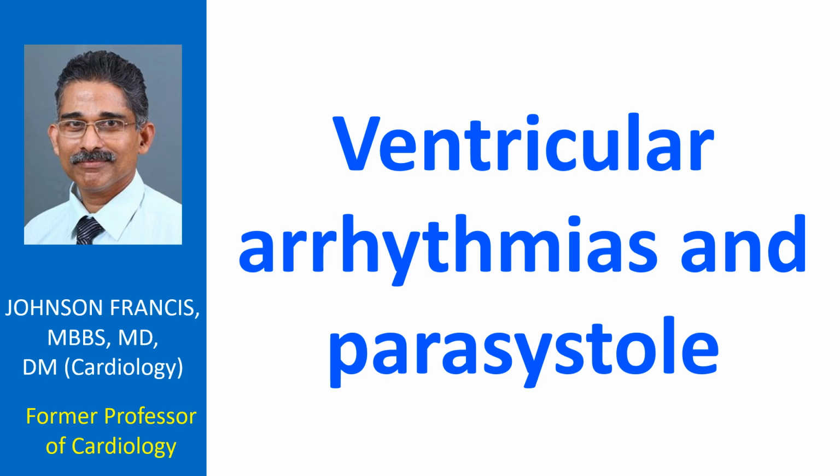Ventricular arrhythmias have a wide QRS due to slow conduction through the ventricle outside the specialized conduction system, with QRS width more than 120 milliseconds. P waves are either absent or dissociated from the QRS. The mechanisms of ventricular arrhythmias could be reentrant circuits, automatic foci, or triggered activity.